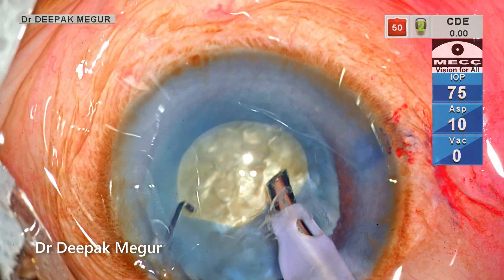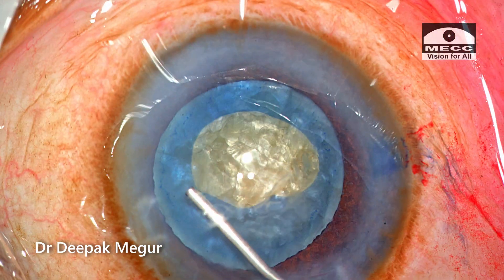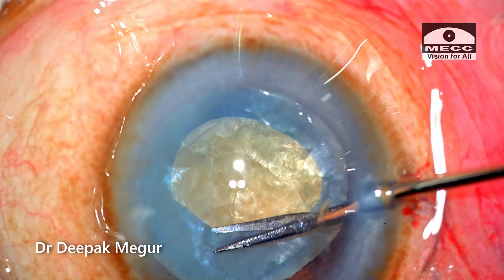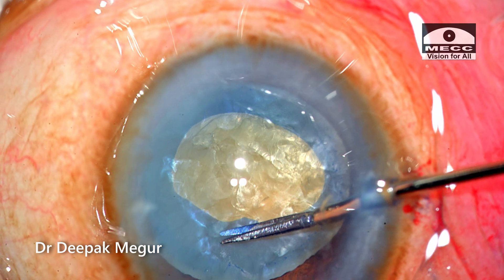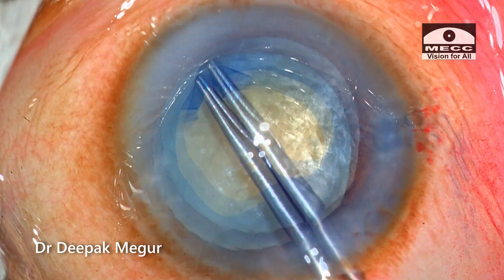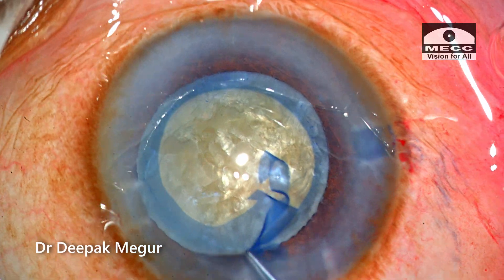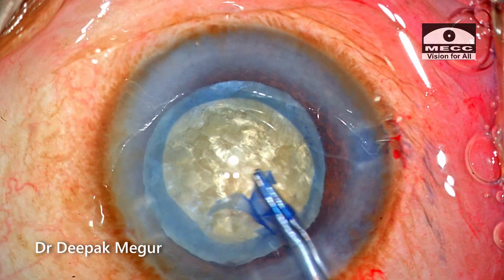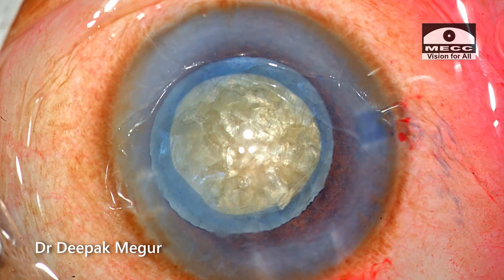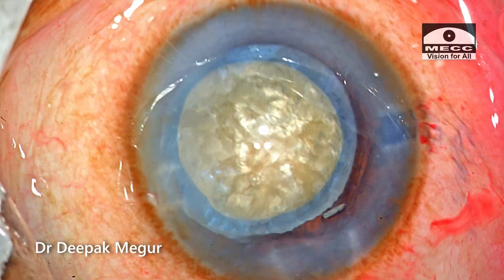I'm now convinced that the intracapsular pressure has been decreased significantly. I come out, OVD is injected, and then I need to enlarge the rhexis. Using micro scissors I'm giving a tangential cut, and then the rhexis is enlarged. I now have a decent-sized opening of about 5 millimeters, which is adequate and very well centered. Now I begin the nucleus management.